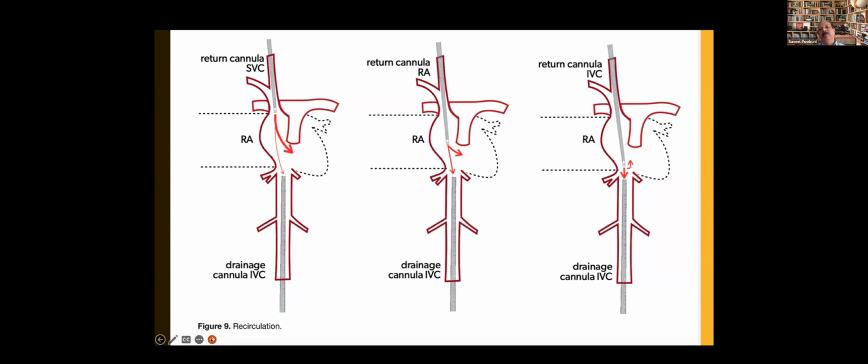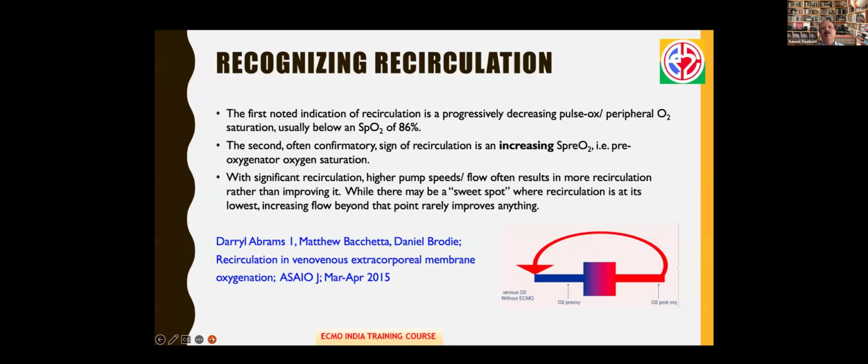It is possible when the patients are being moved and subject to physiotherapy, walking and all these exercises, then it is likely that the cannula can migrate, can go in, can go out as well. But this happens when it goes in.